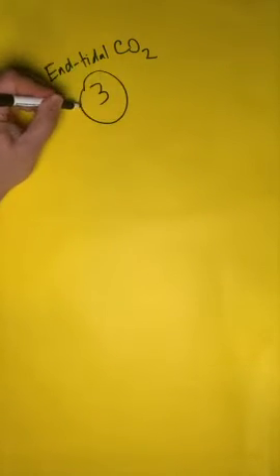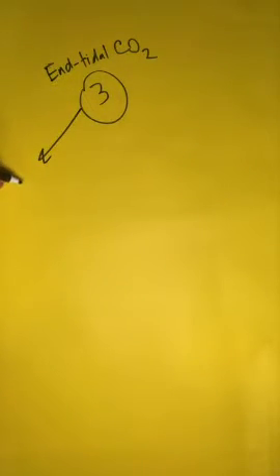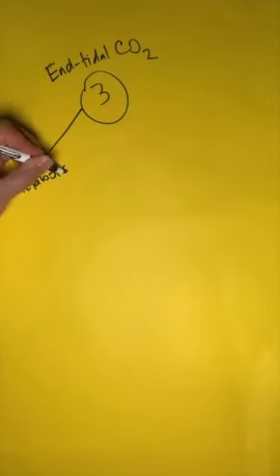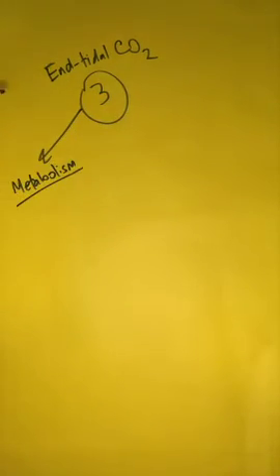Now, for a person to generate end-tidal CO2, you need three things. The first thing you need is cellular metabolism, because cells make CO2. This is actually going to help us to monitor certain disease states.